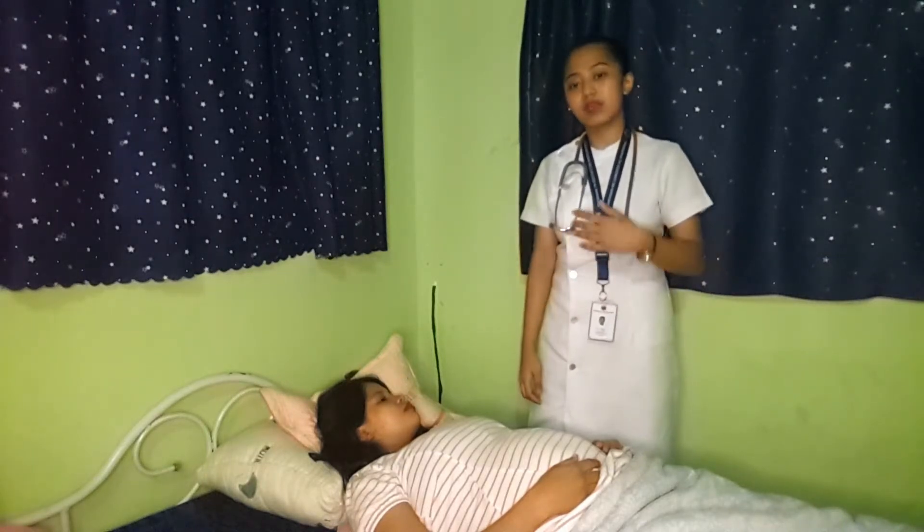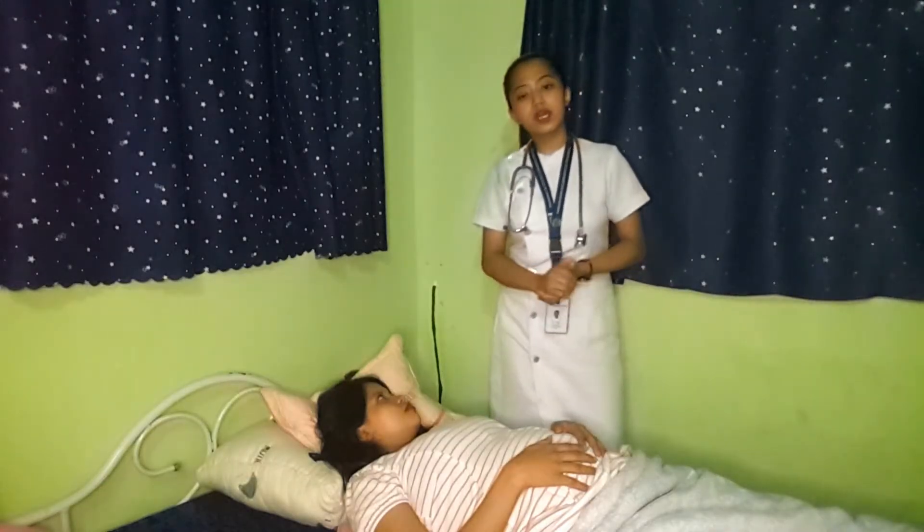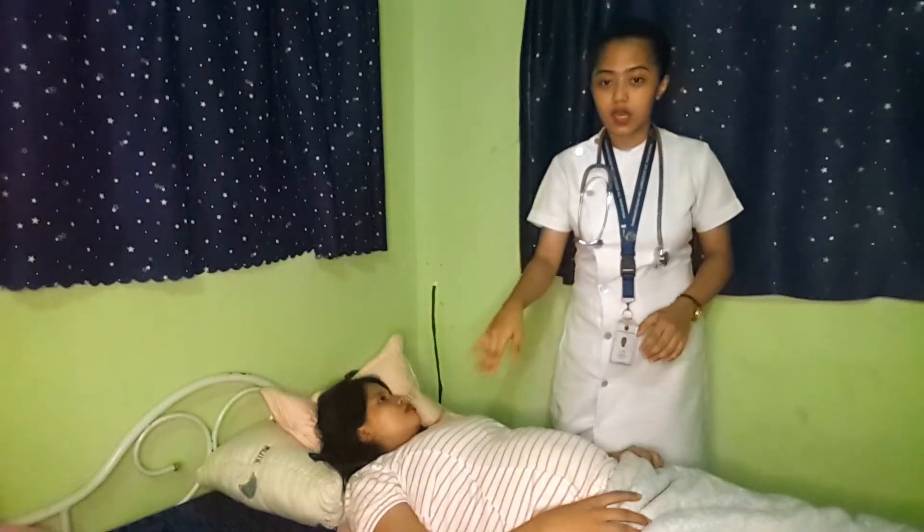We will now proceed to Leopold's maneuver together with auscultating fetal heart rate. The rationale for doing this is to determine the baby's position as well as its heart rate. When doing Leopold's maneuver, we need first to obtain the client's OB history and determine the client's weight, vital signs, LMP, and AOG. The equipment we will be needing includes a stethoscope, Doppler if available, pillows, and a watch with a second hand.